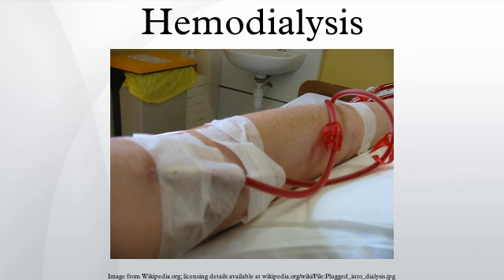This forms the blood compartment of the dialyzer. Two other ports are cut into the side of the cylinder. These communicate with the space around the hollow fibers, the dialysate compartment. Blood is pumped via the blood ports through this bundle of very thin capillary-like tubes, and the dialysate is pumped through the space surrounding the fibers. Pressure gradients are applied when necessary to move fluid from the blood to the dialysate compartment.